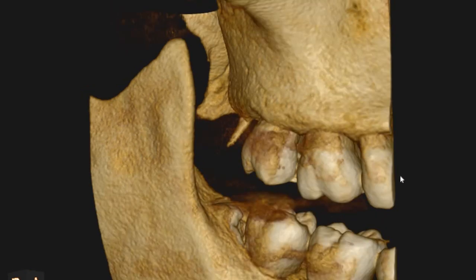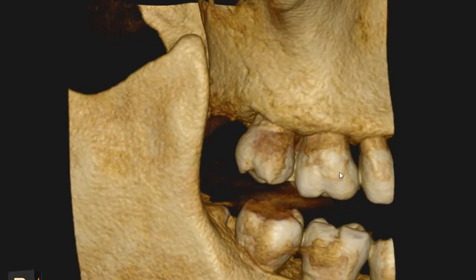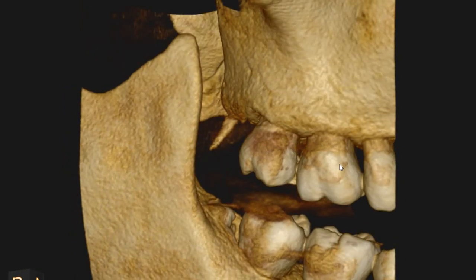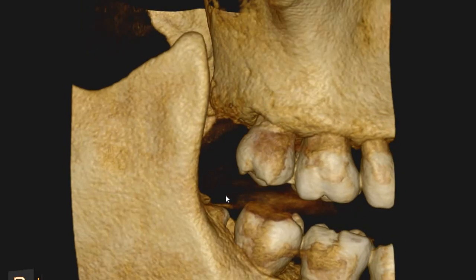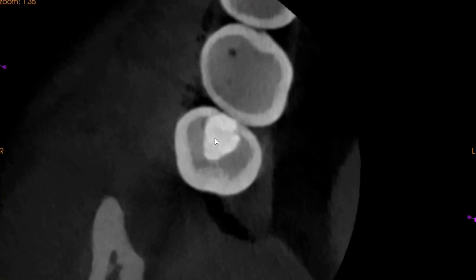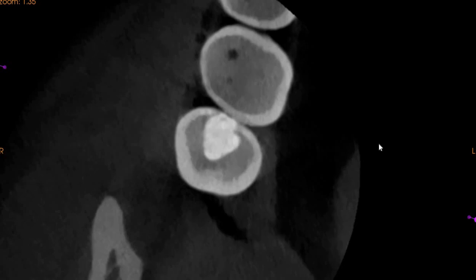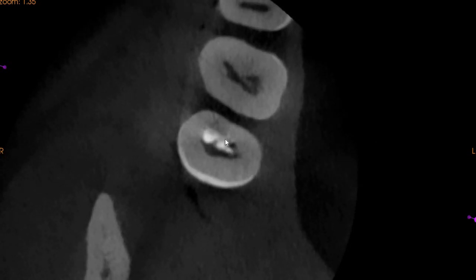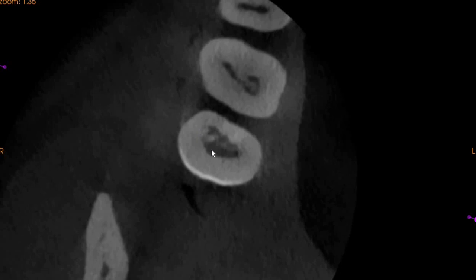Hello and Assalamu Alaikum. Ultra Scan Diagnostics here. This is the high-resolution endodontic mode of the upper right quadrant. The area of interest is the upper right second molar, which has had root canal treatment done. On the axial view, this is the temporary restorative material. As we move down apically, the chamber opening is located quite centrally in the tooth.